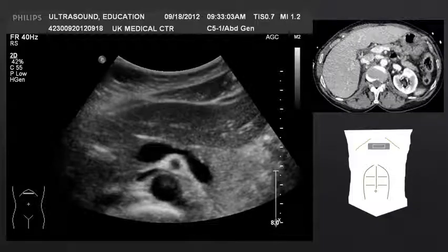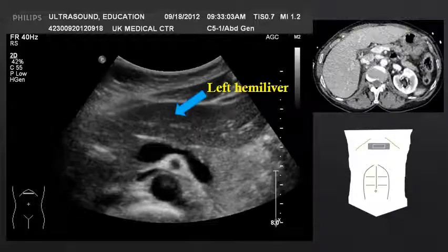We start with a transverse view of the abdomen, just below the xiphoid process. The first organ within our field of view is the left hemiliver. We can see in the image in the right-hand corner of our screen a CT, which allows us to correlate the ultrasound image to the CT image.